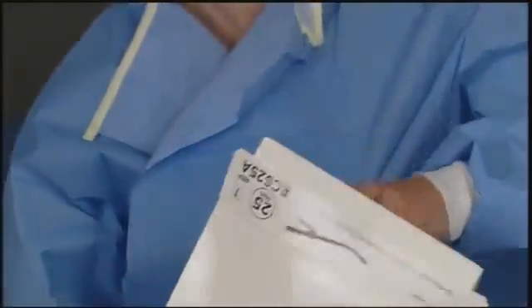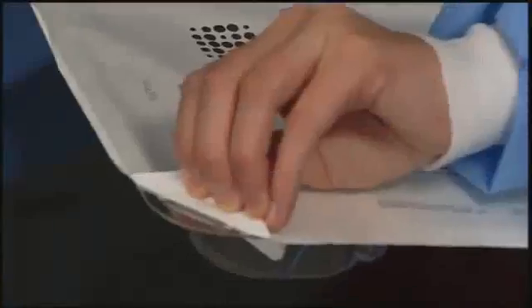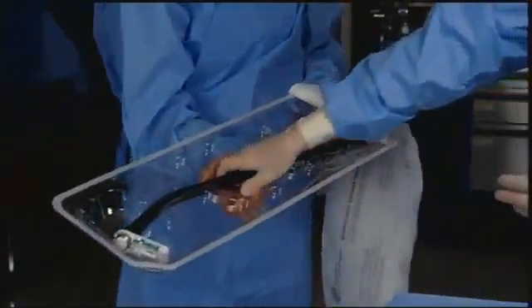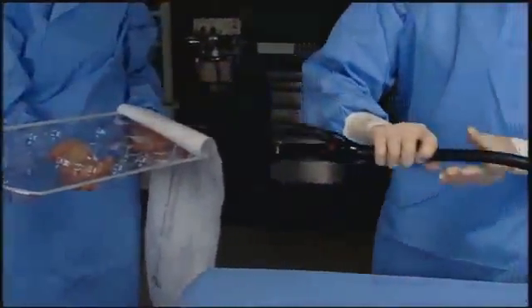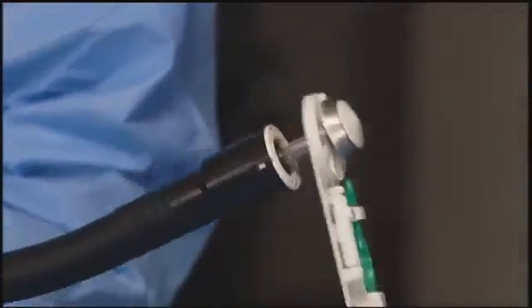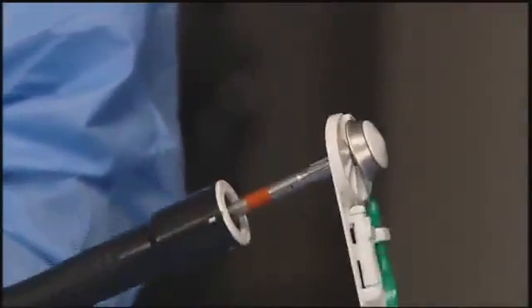Using sterile technique, remove the instrument from the package. To remove the spacer tab, open the instrument by turning the adjusting knob counter-clockwise two revolutions.